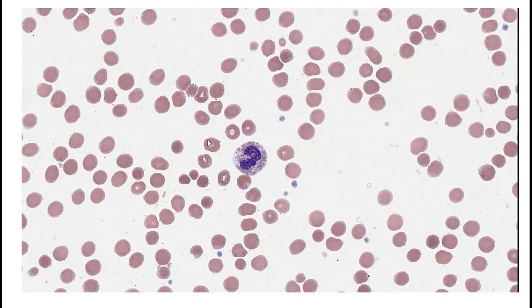And this one is interesting. It looks like lots of spherocytes. You're right, there are lots of spherocytes. These spherocytes are microspherocytes, like this one in the corner here, and this one is from a burn patient. This patient was from a plane crash, and the patient did not survive. It's a very sad case. So the patient came to our hospital, and both patients died, plus a number of patients suffered severe injury.